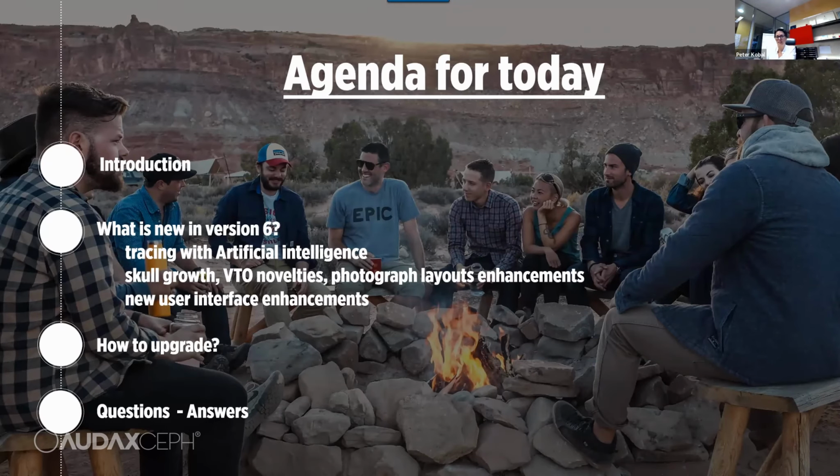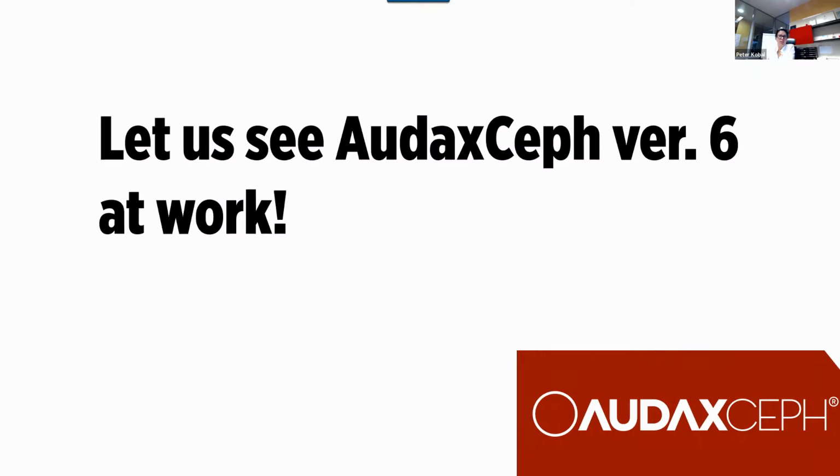The agenda for today's webinar is the introduction, which I'm almost done with. Then Peter's going to take the hot seat and give you a demonstration of AudaxCeph Ultimate. He's going to show you tracing with artificial intelligence, skull growth, VTO novelties, photograph layout enhancements, and new user interface enhancements. At the end, we're going to take a couple of minutes to talk about how to upgrade your software from your current one. And also, again, we are going to answer any questions that you have. I would like to again encourage you to take advantage of this, so that we can answer all your questions immediately. So let us see AudaxCeph version 6 at work.